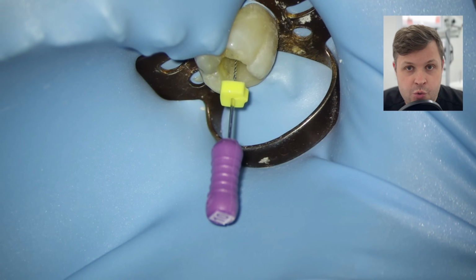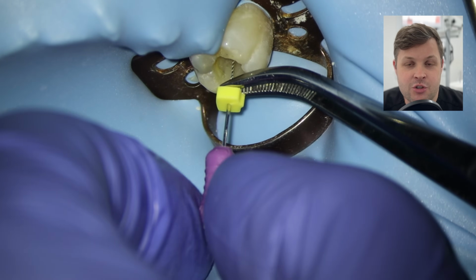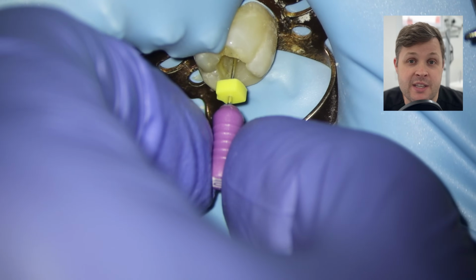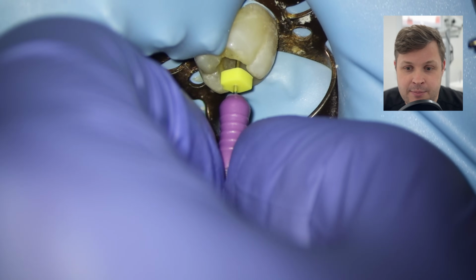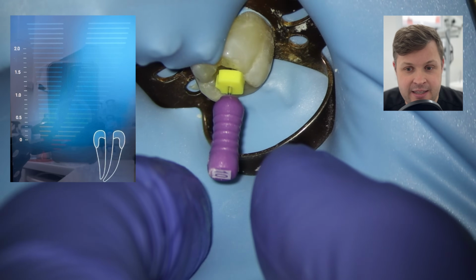And once we have opened up the canal space, I'm now going to try and negotiate down to 0 with a size 10K file. I'm just going to adjust the rubber stopper here, and it is moving down a little bit easier in this case.